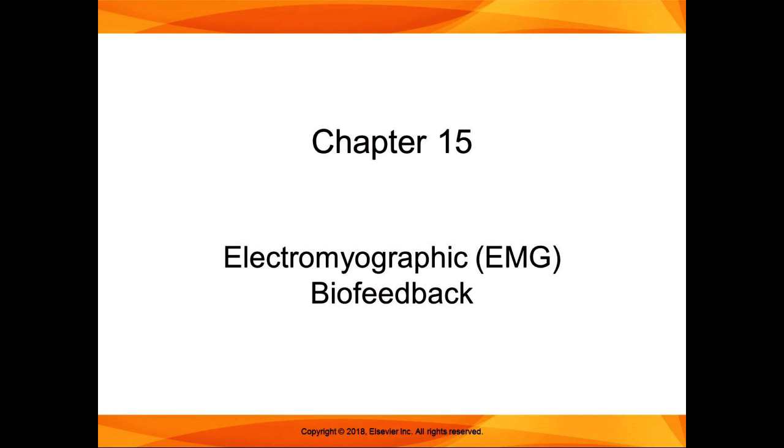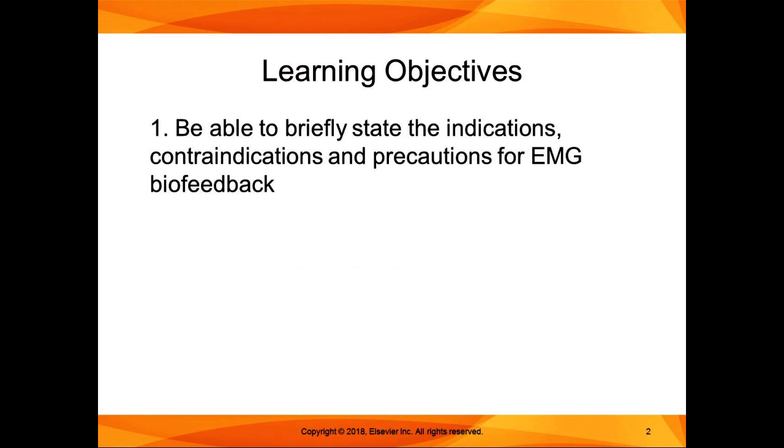Right, so chapter 15 is on biofeedback, and specifically on electromyographic biofeedback, or EMG biofeedback. This uses a particular device to give a person feedback on a physiological process, usually a muscle contraction, so that person can self-regulate that process. Really, we're going to just briefly touch on biofeedback.